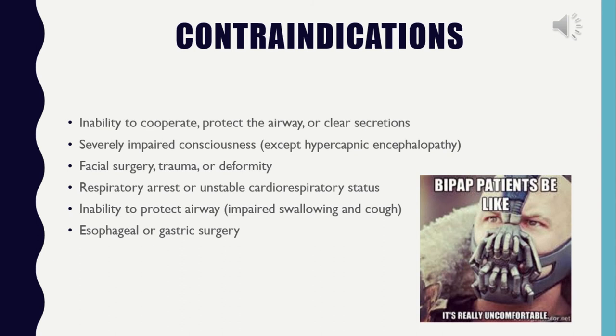Any inability to protect the airway, if they are unable to swallow or cough efficiently, we would need to consider not putting on the BiPAP machine. And of course, as discussed with the physician, any esophageal or gastric surgery that would prevent them from being on a BiPAP.